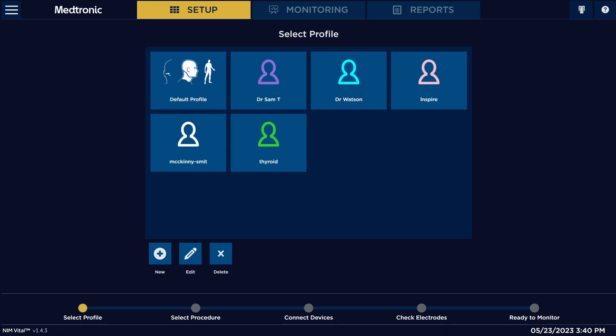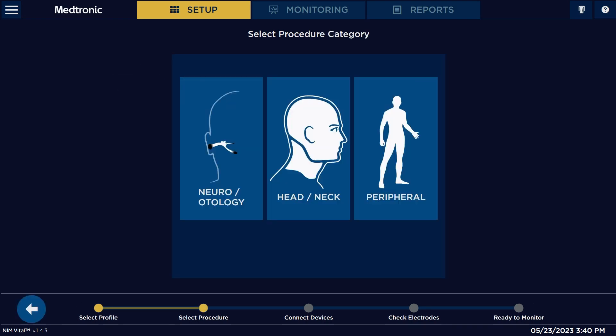Once it's on its main screen, you're going to want to select the profile that you're going to want to use. It's set to default profile, and then you're going to select the different type of procedure that you want to do. It's set up for neurotology, head and neck, and peripheral.